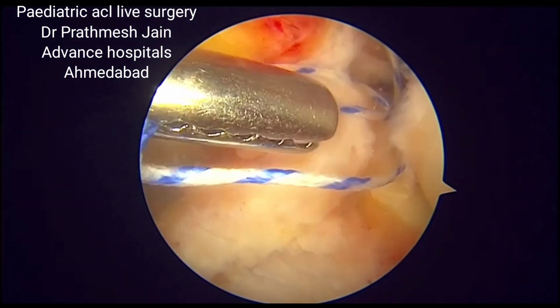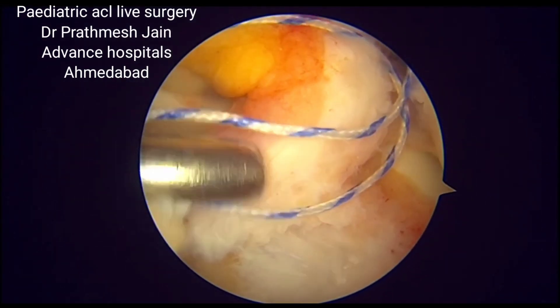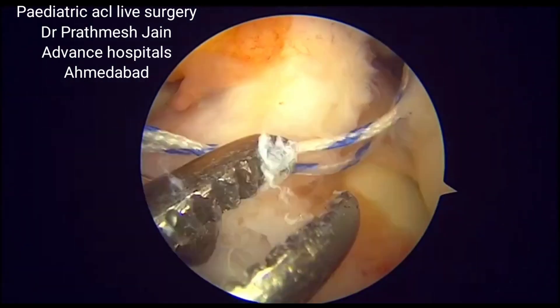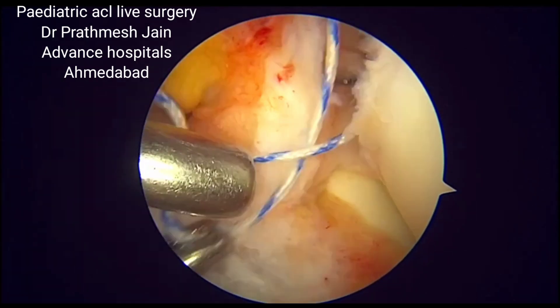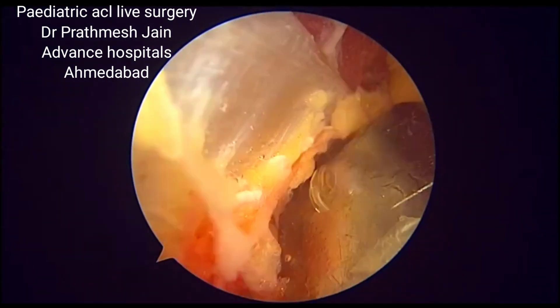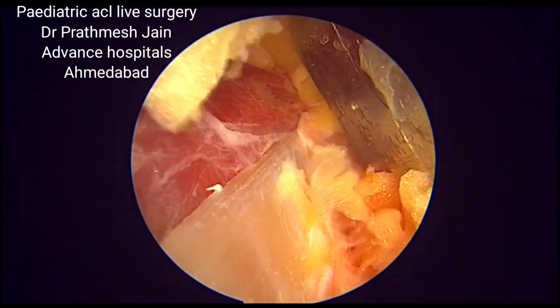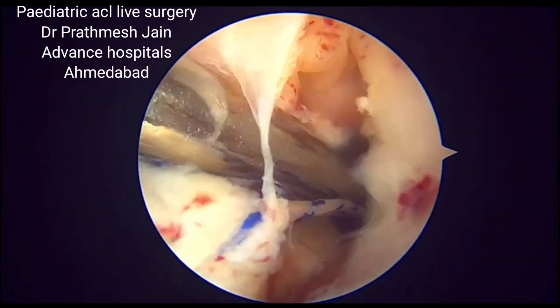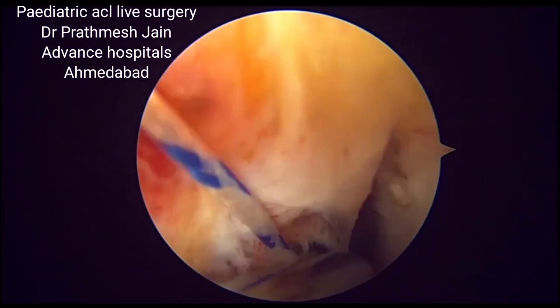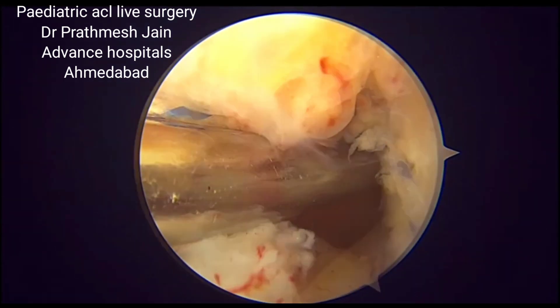Here we are passing the suture through the anterior area just anterior to the notch, beneath the anterior intermeniscal ligament, and then we pass the suture from the posterolateral recess via the posterolateral portal. You can see we are harvesting the graft nicely and feeding the wire into the posterolateral compartment, which will then be pulled back from that compartment.